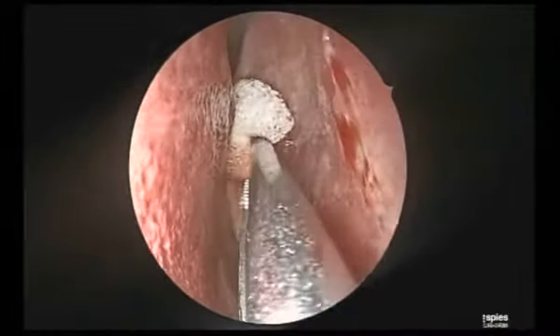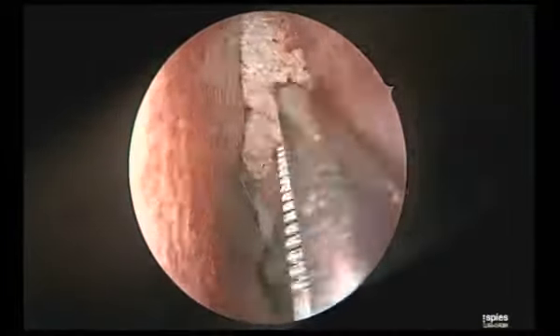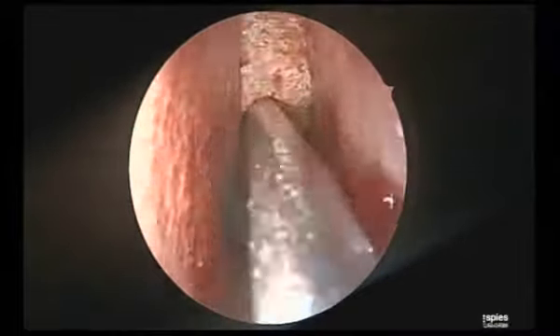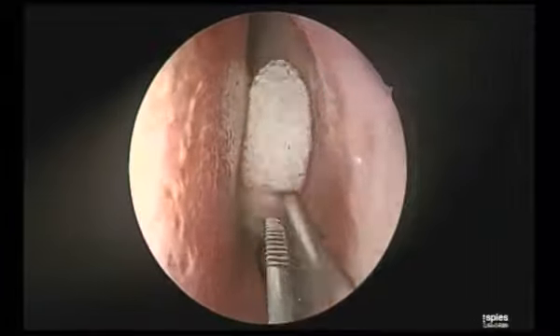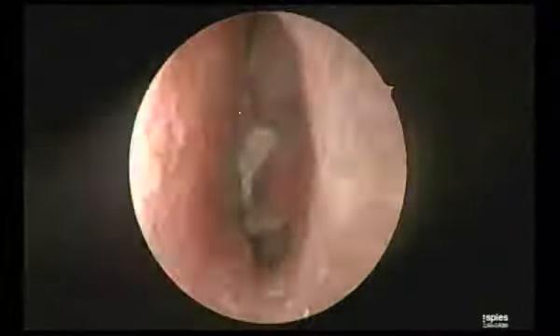Then you dip in the solution. I use only topical. I don't infiltrate at all. I believe in only topical decongestion, and there are papers. I've been following this for many years. There is no difference in the overall bleeding, whether you infiltrate or not. If you decongest topically properly, that's good enough, and I'm happy with that.